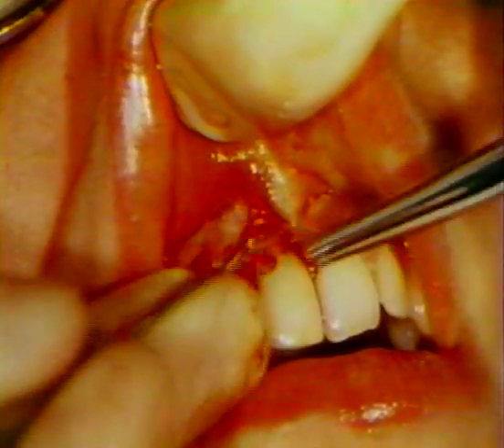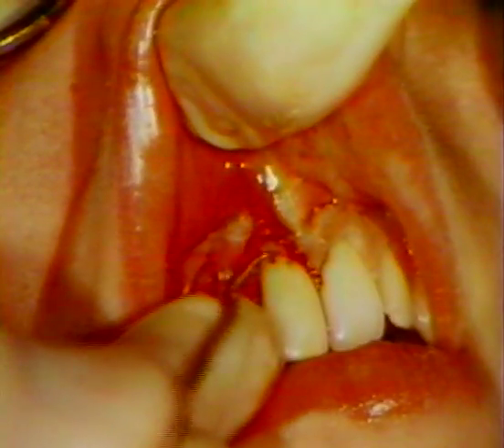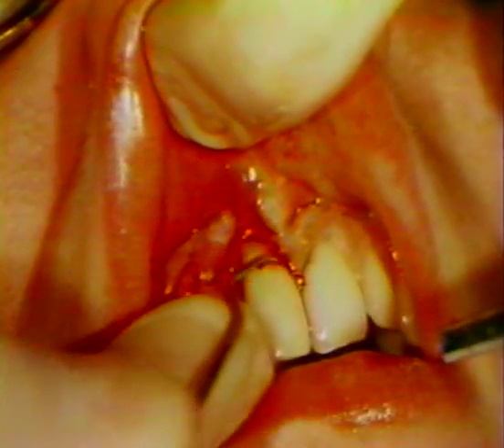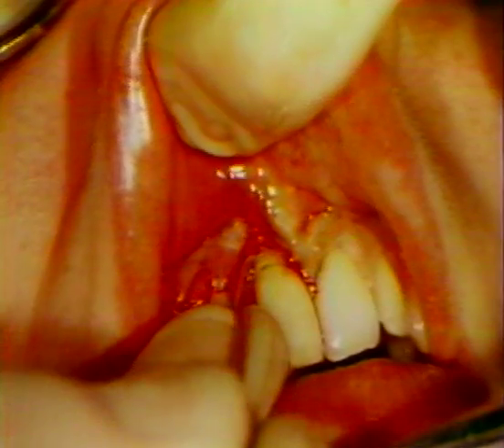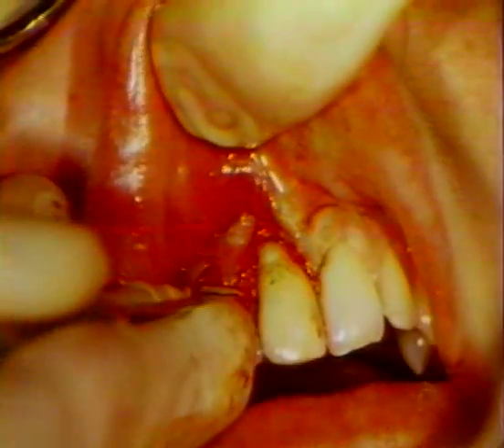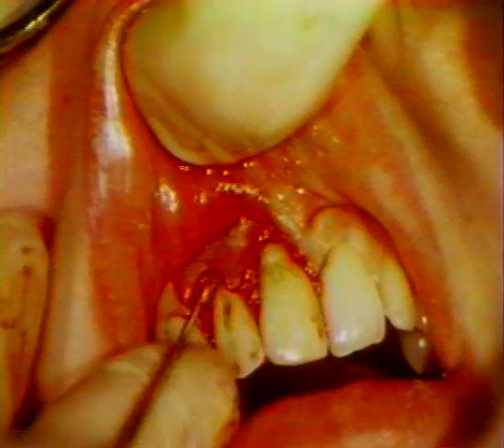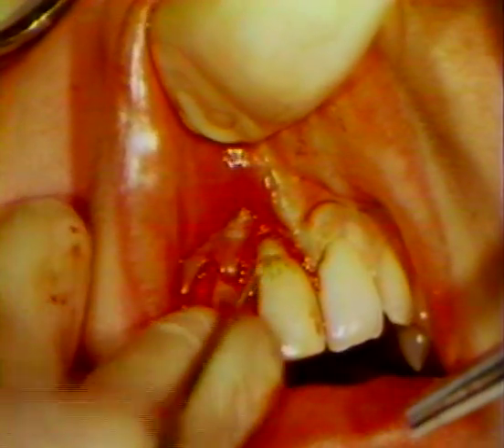A thorough root planing is performed on the labial surface of the central incisor to facilitate the attachment of the flap. The lateral incisor is also planed slightly to assure good flap adaptation and healing.